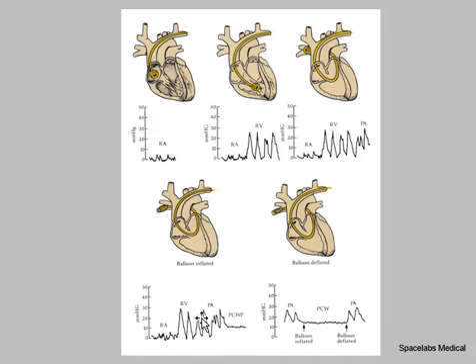Once in the pulmonary artery, it's then advanced further and lodged into the wedge position, pulmonary artery wedge. Here it is labeled pulmonary capillary wedge. That is a misnomer. It's a carryover from bad nomenclature in the old days. It's not a pulmonary capillary pressure. You're nowhere near the capillaries.